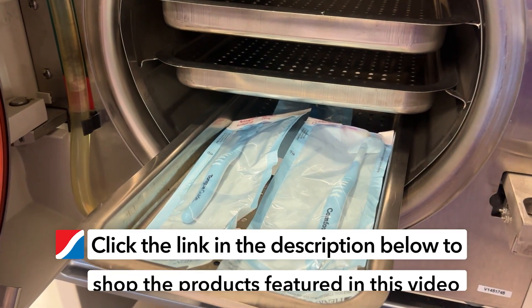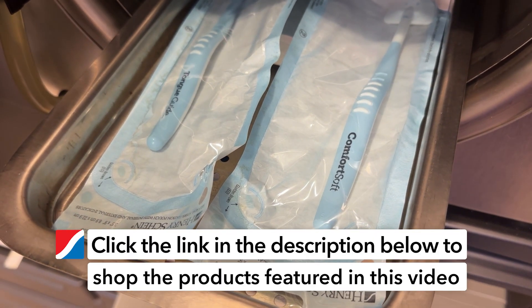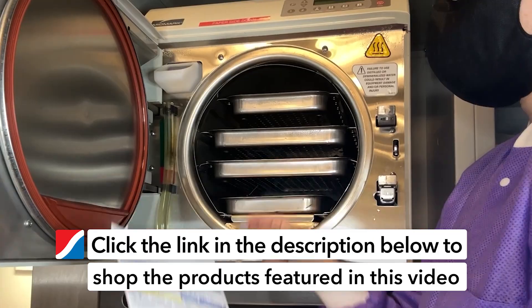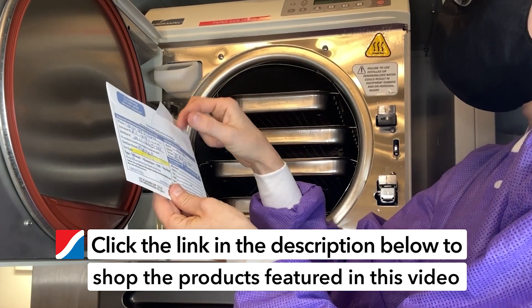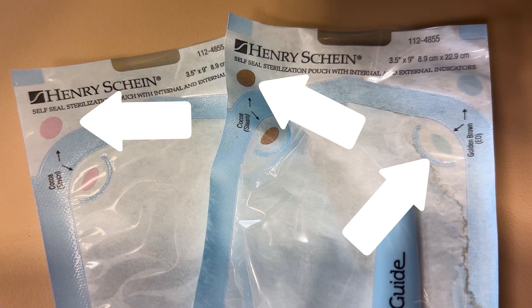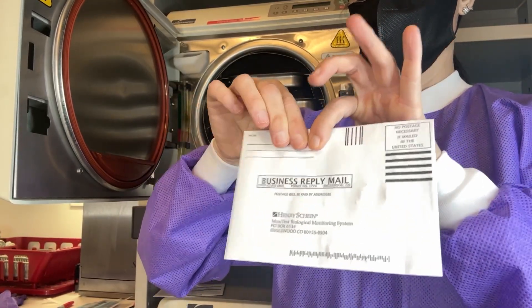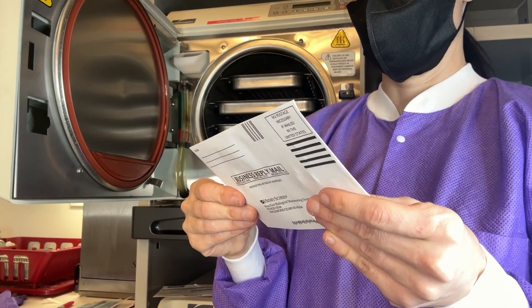It's important to monitor each sterilization cycle with mechanical, chemical, and biological indicators, often called spore testing, to ensure that the process is working correctly. Mechanical indicators involve checking the sterilizer's cycle parameters. Chemical indicators change color when exposed to the conditions, confirming they are met. Biological indicators involve using spore tests to verify the killing of microorganisms.